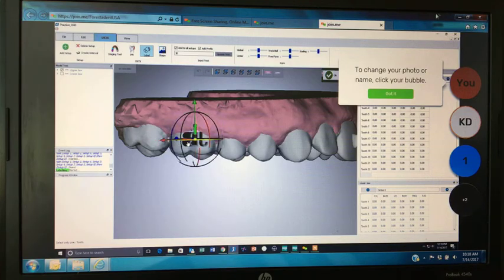So I'm going to give it a little extra space here, because what the program's going to do is actually put that number in there for you. So I'm going to scoot that over. And again, you'll want to make sure it's not too far out, which that kind of looks like it's a ways out. Okay. And you can go ahead and tilt these too. And then I'm going to click OK. And you'll notice now the software's labeled setup 0, 1, 2, 3.